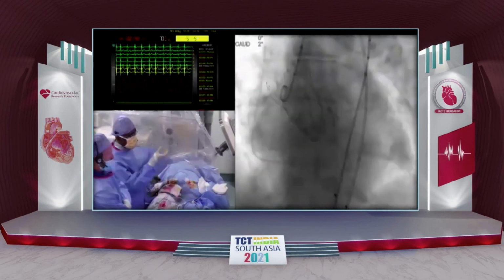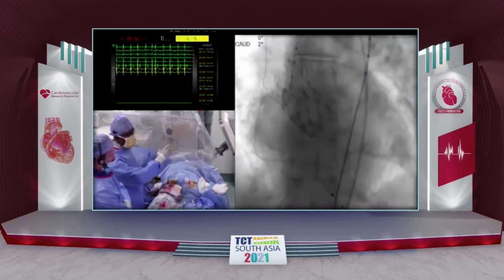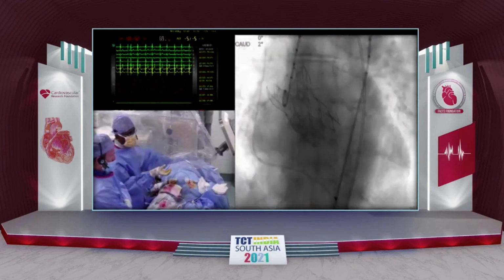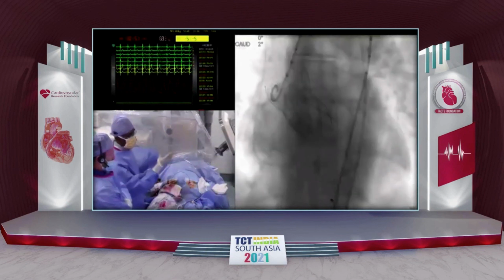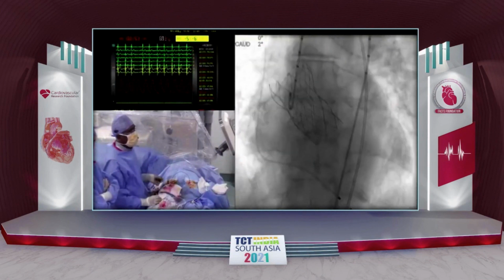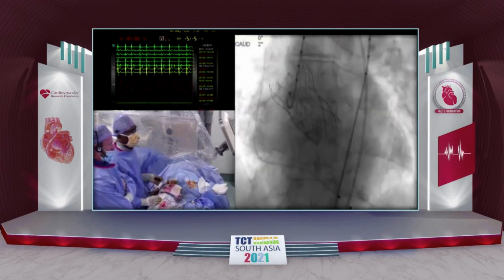At 1/3, advance the catheter forward. That will line the greater curvature, which is what a double S curve wire will do for you. And that will then tilt the valve up to meet the left coronary, and that will fix the extreme horizontal anatomies as well. Thank you. That's a great point. Many of the times, the easy solution you are saying is this newer valve, which will help in most of the situations.